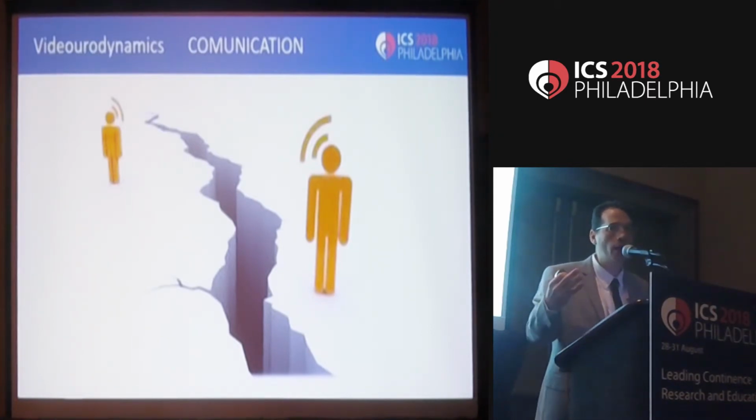You can ask the patient just to raise a hand when he feels the first desire to void, but at other times the patient has no possibility to understand their own needs. So you have to trust your trace and your images.